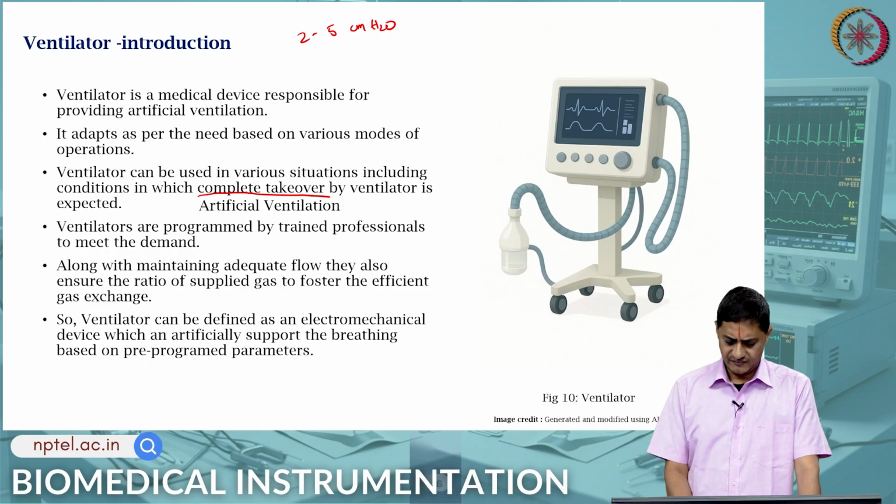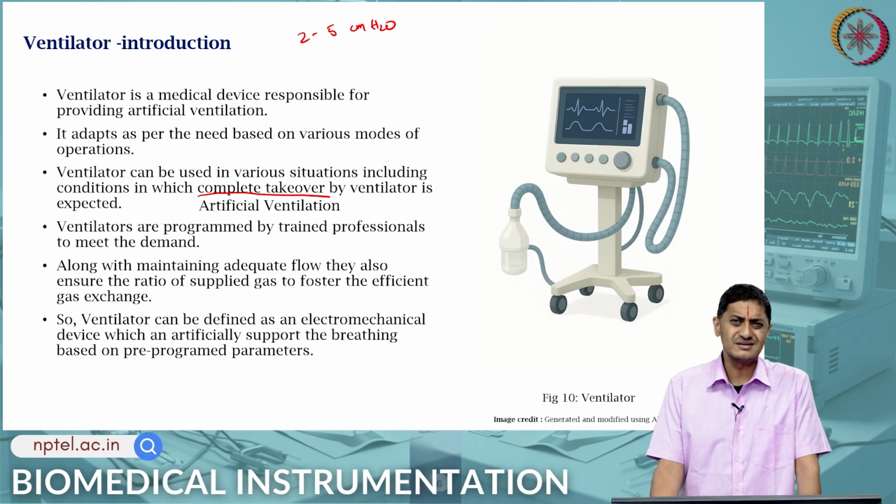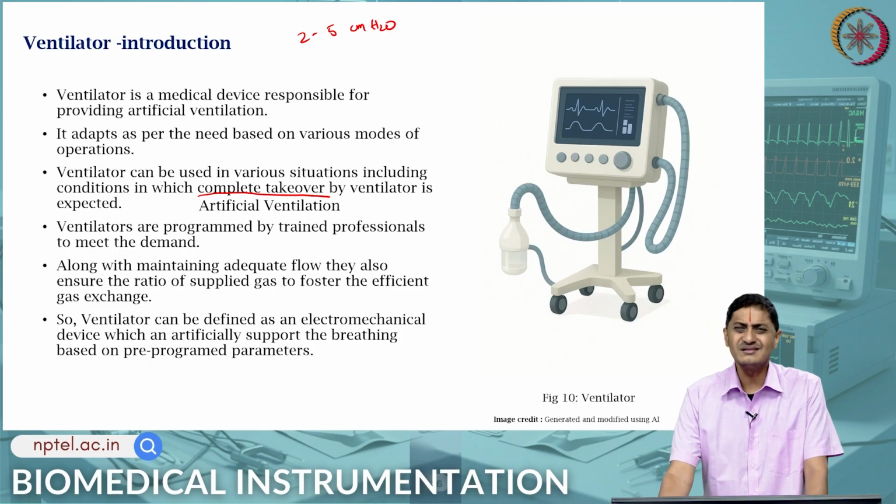Essentially, your ventilator adapts to the needs of the patient. It should, but the primitive elementary ventilators do not do that. They were rather open loop, but the current present day ventilators are closed loop feedback systems that adapt to the needs of the patient. Now, what is the physics behind the operation of the respiratory system and the ventilators?